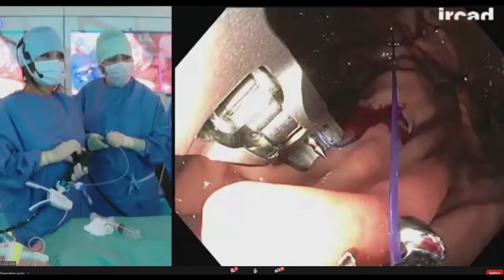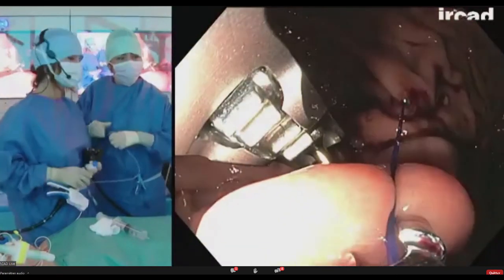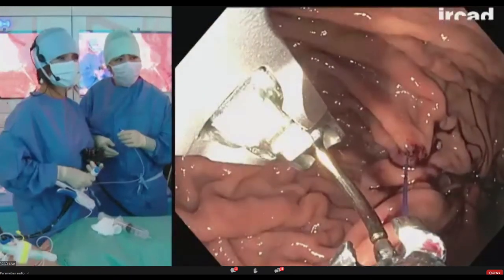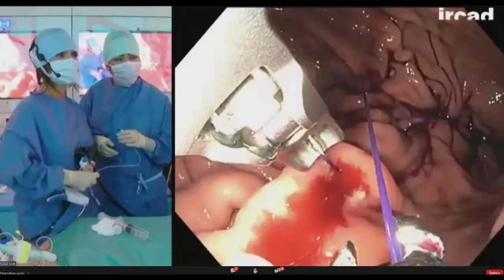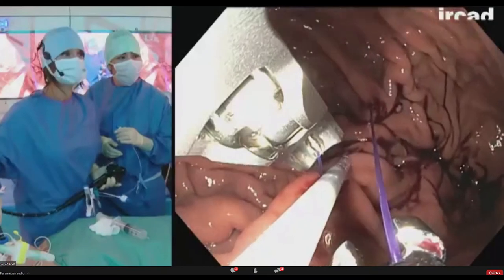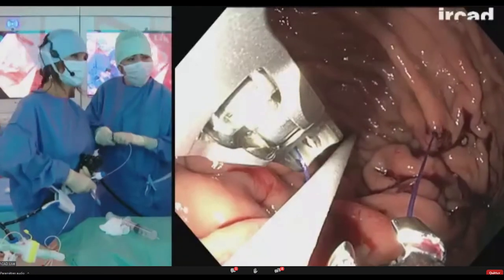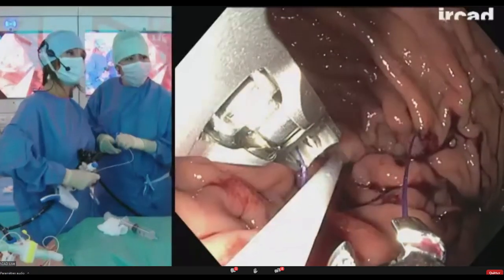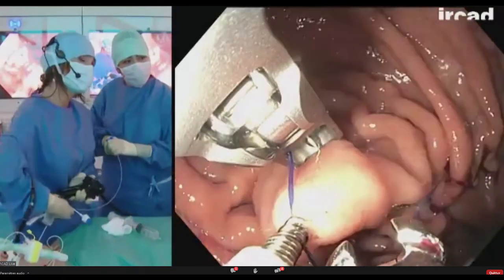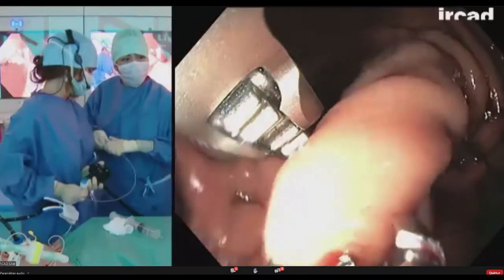And also, if you do a gastric bypass, you shouldn't approach even the territory where the sutures were placed at the endoscopic procedure, if you do it under endoscopic control. It is recommended because you will feel more comfortable and you will avoid stapling the cinch, the plastic part. Stapling on the suture, stapling onto a little metallic T-tag, is okay. But the cinch can actually create some problems with the staple.